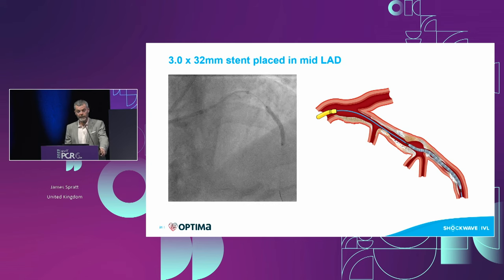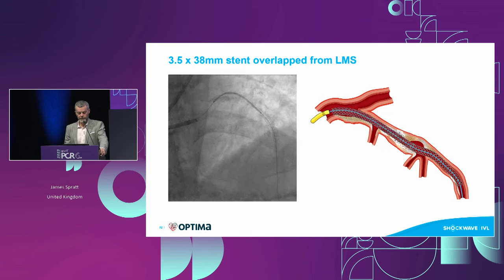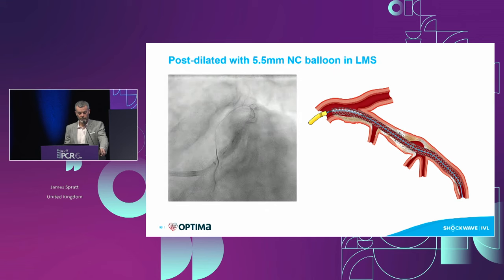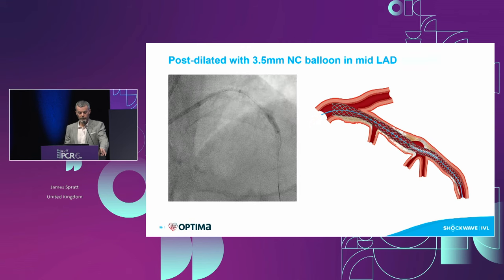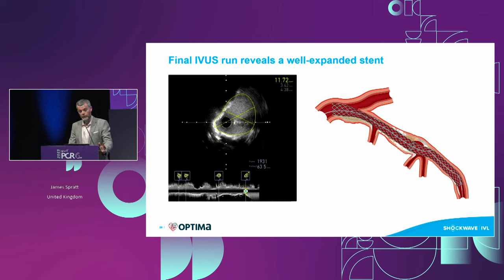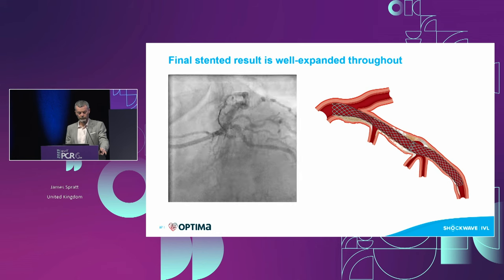Because we've changed the compliance of the vessel, it's easy to deliver what is essentially a rigid structure — the stent. We place two stents, proximal and distal, with a size discordance over such a long length. Proximal optimization in the left main with a 5.5 balloon — IVUS guided — then expand the stent throughout its length with a 4.0 balloon and 3.5 balloon distally. At the end we confirm good stent expansion with no vessel trauma. The ostium of the LAD is nearly 12 mm², so a great result, with an excellent angiographic result in the left main.